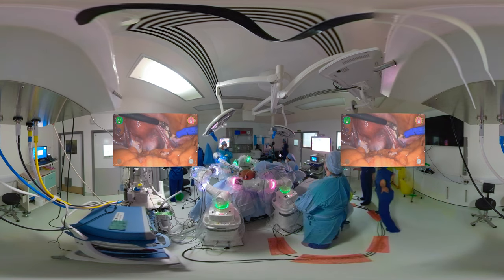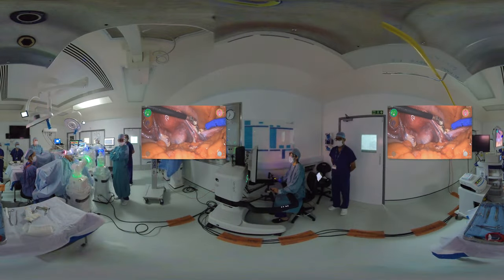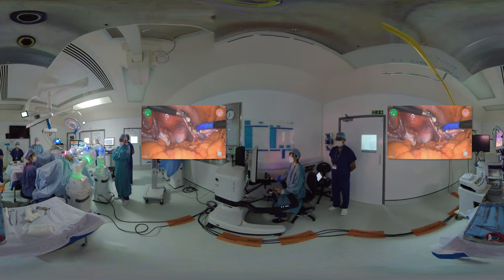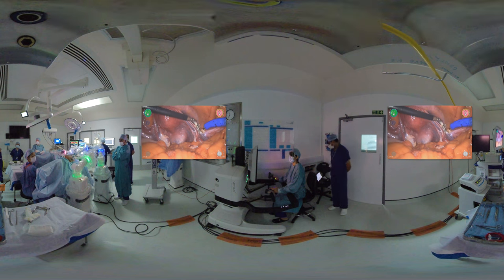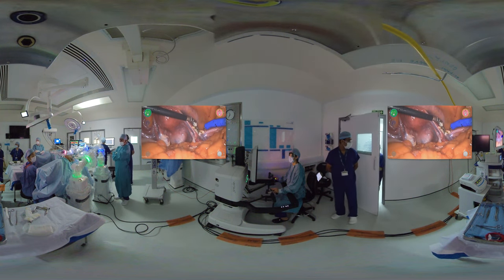Coming back to the surgery, we have almost finished dividing the round ligament on the right hand side. We're now going to separate the folds of the broad ligament so that we separate the anterior and the posterior folds, so that we can then dissect the bladder down on the front and also skeletonize the uterine vessels around the lateral edge of the uterus. Here we are carrying on with that process.